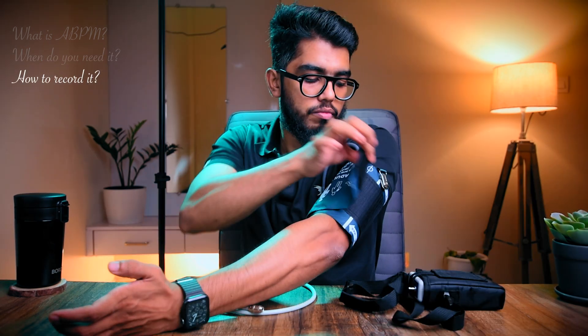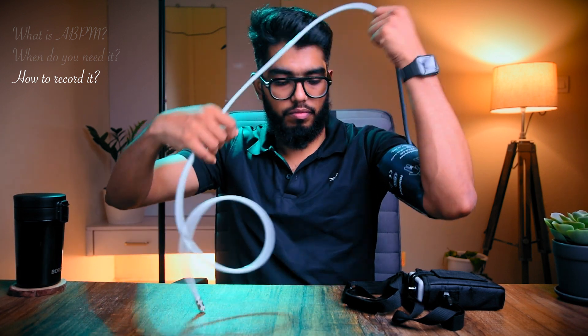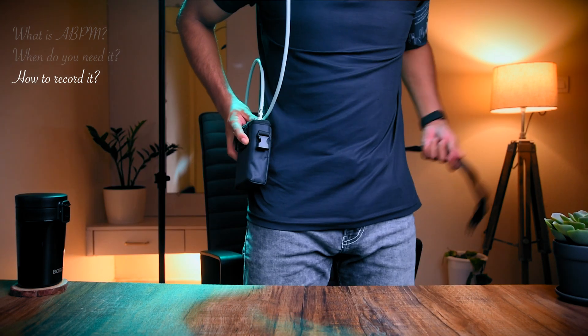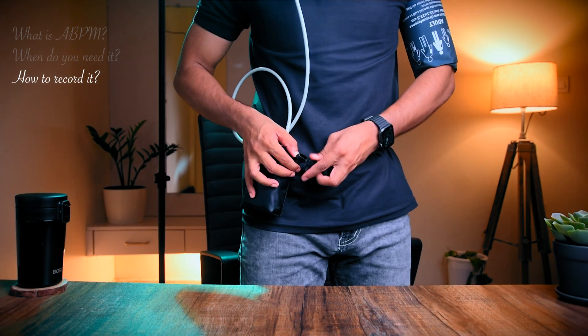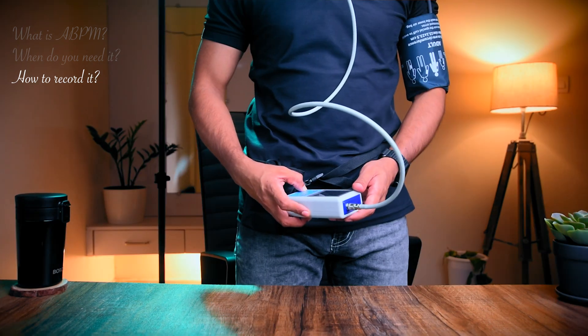How do you record it — what's the procedure? The blood pressure cuff is wrapped and fixed around your upper arm. Either arm can be used, and you hang the rubber tube around your neck to connect to the monitor. The digital blood pressure machine itself is attached to a belt around your waist or your shoulder. The battery life should be sufficient for 24 hours, and do check if the machine operates well.